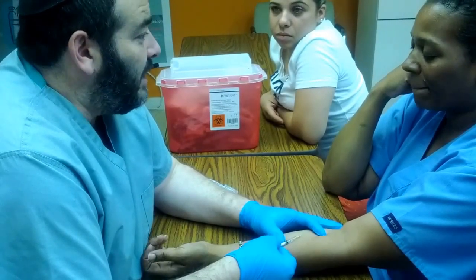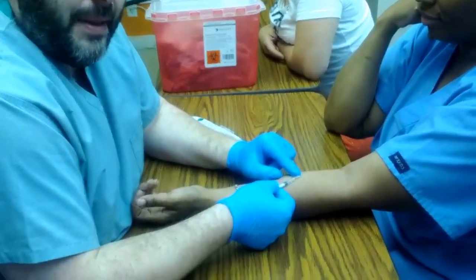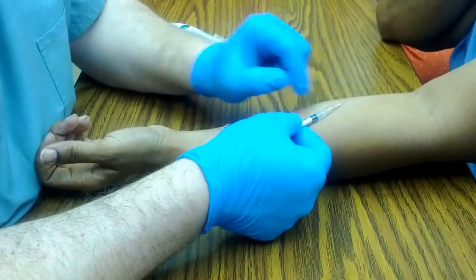Not too much pain though, is there? Now to see exactly where you are, all you have to do is lift the tip of the skin just like so. Can you see it there? Okay, I'm lifting the skin right there. And then I can see exactly where I am. I can see where my tip is.